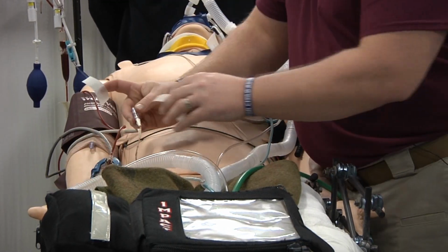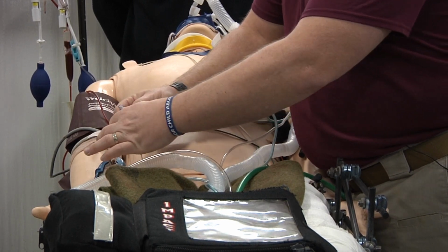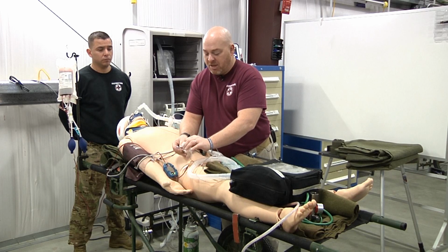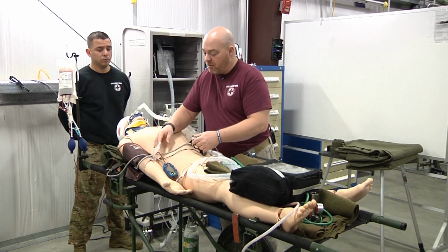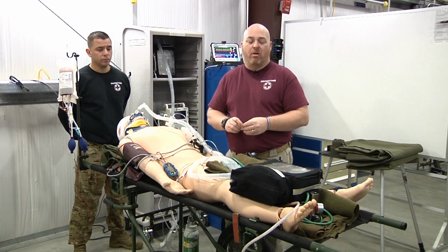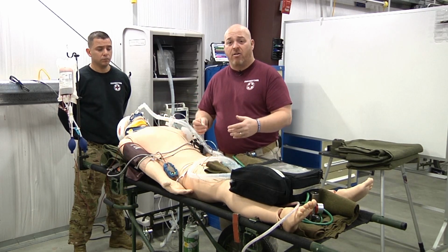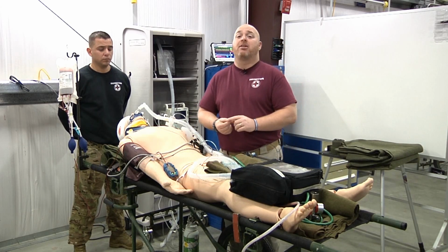Or if I choose to use my central line here as a medication port, I can simply flag it and write M1 on it. M1 lets me know that this will be my first and primary choice for medication, or maybe my peripheral line, maybe I will flag that as M2 to let me know that that'll be my secondary port, or however you want to do it. But once you get all of the stuff on top of the patient and you get into the aircraft, you want to have very easy identification marks to help you find what you're looking for.